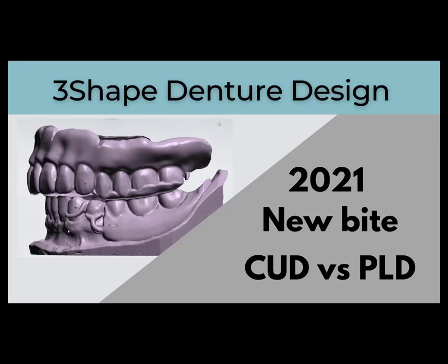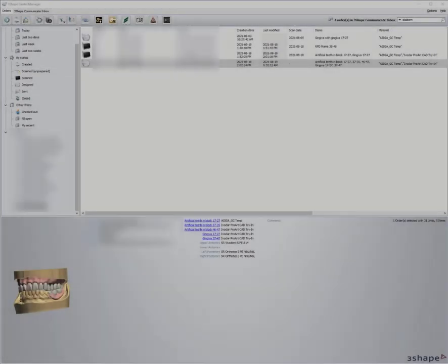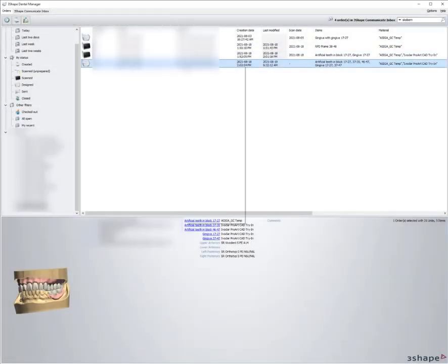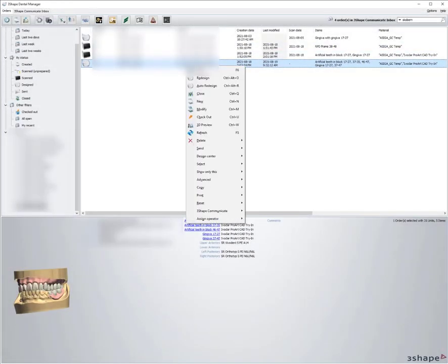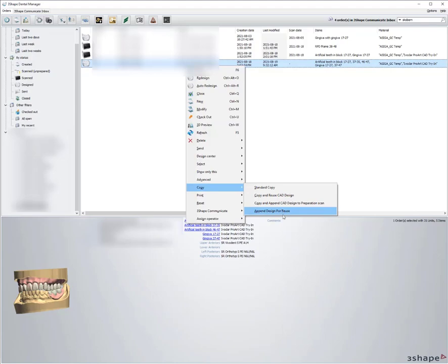Let's talk about scanning a new bite in the 2021 software. If we've designed a complete denture with a partial denture at the same time and we do a copy and reuse CAD.